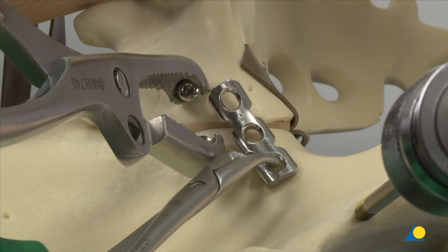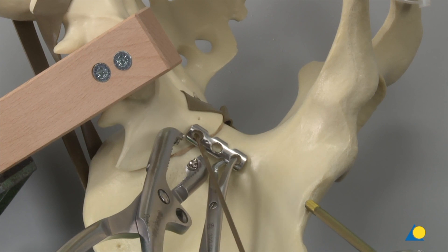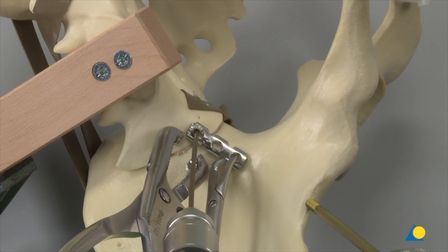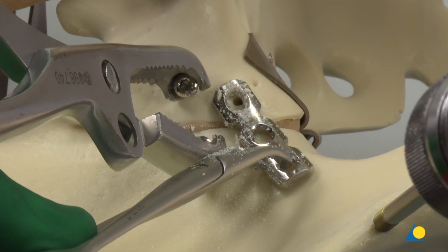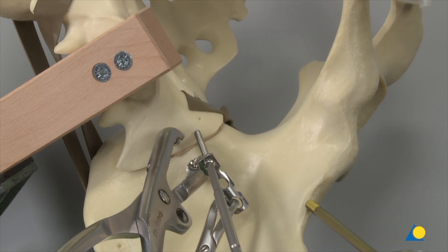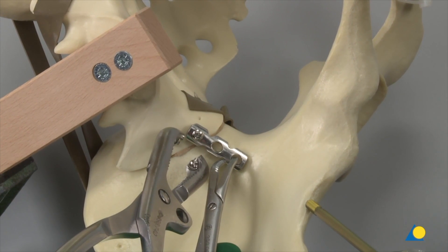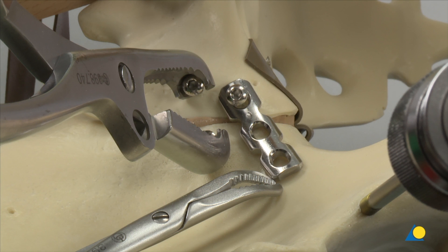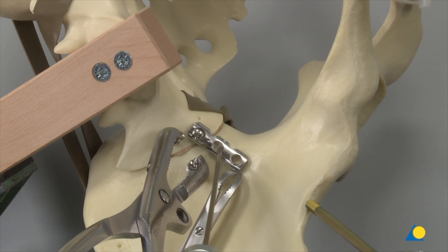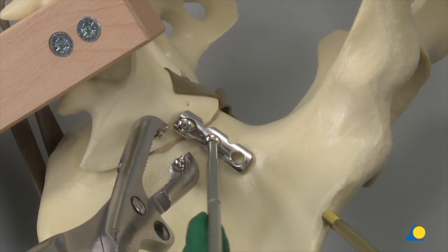A 3-hole 3.5 reconstruction plate is contoured and positioned over the distal part of the sacroiliac joint. Drill the first 2.5 mm hole into the lateral part of the sacroiliac joint. Remove the plate, then reinsert it together with a 3.5 mm cortex screw of appropriate length. This technique prevents the screw being lost because it is held and guided by the plate. The plate is repositioned and the remaining plate holes are filled. The screws are normally inserted by machine and tightened by hand.